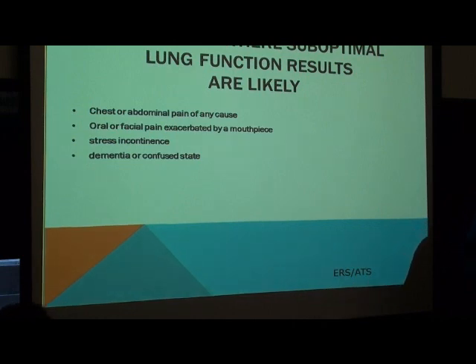How often do we see somebody who's here for open heart surgery, who has had all of their teeth extracted from dentistry, and then we're routed to us for a spirometry test? That definitely is not a great situation. Most of the time we really defer that patient to be tested at a later date when their mouth is not packed with gauze.